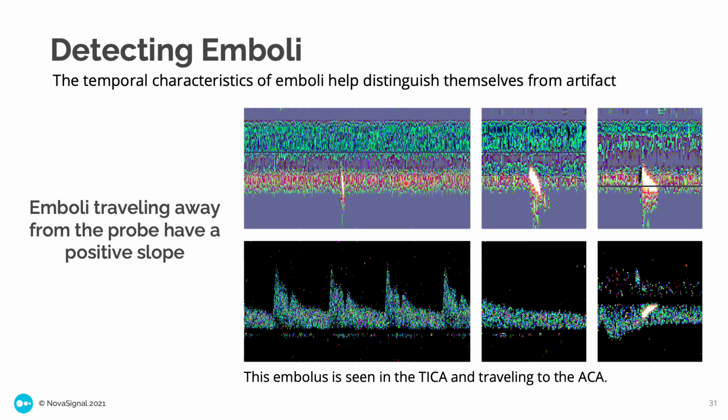What is important to note is where your sample volume is placed. If we do an emboli or bubble study with just Doppler alone, we are only listening at that particular depth. We are not listening across multiple depths. This is the reason power M mode makes detecting emboli or bubbles more accurate, because we are listening across multiple depths. This first slide is a good representation of this.